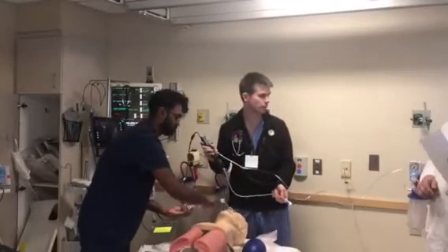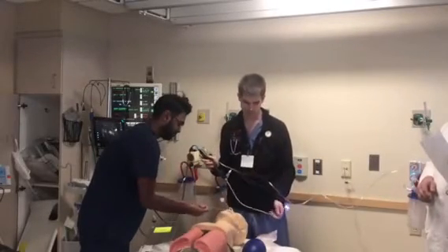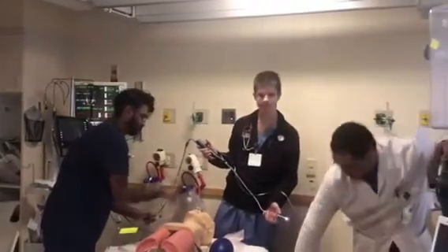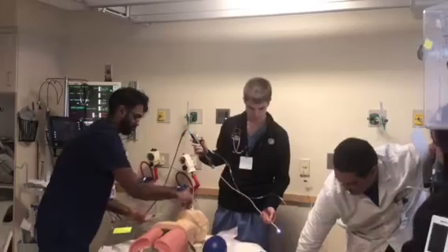So let's set him up right, so that he's not vomiting down his airway. Okay. So we'll move the bed up. Yeah. We get another nurse over here. Yeah. Guys, nurses. Wow. All the nurses left. All the nurses left. All right.